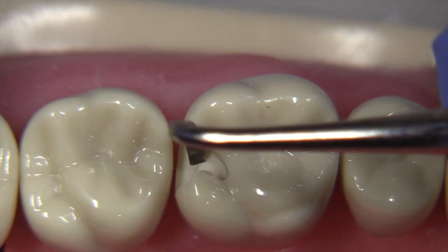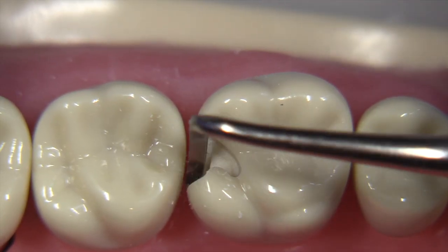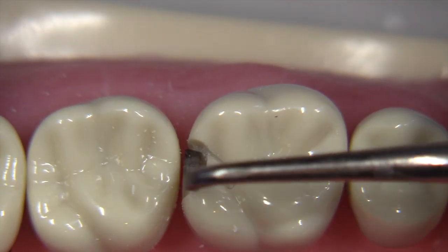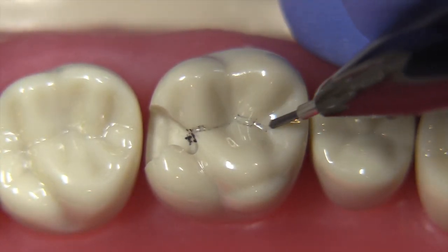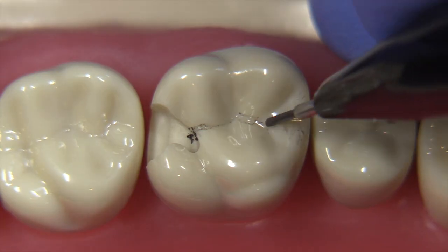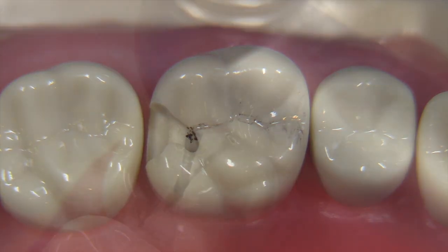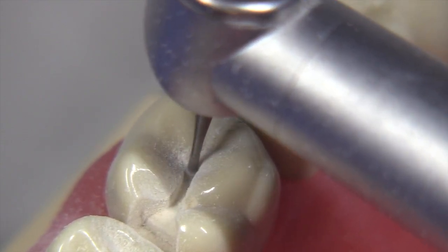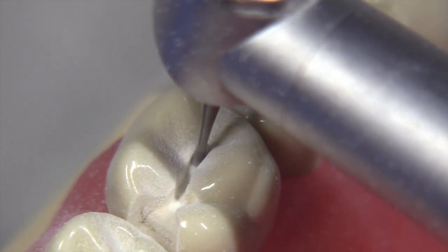You can also use this from the middle of the lingual to finish that bevel, and of course remove any loose enamel rods down at the gingival. There's a shadow down there that makes it look like a bevel but it's very modest. Now we're going to assume that the preparation had to cross the oblique ridge, so we're going to map out in our minds where we're going to be headed. Just like we did on the DO preparation, we're going to start with the bur sliding in rather than doing a punch cut.